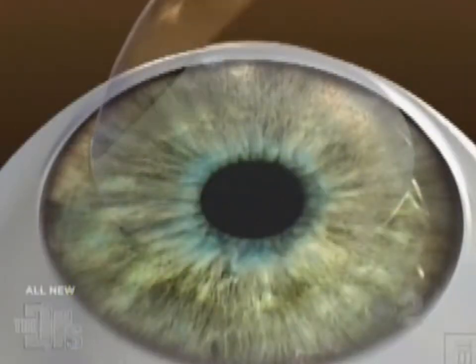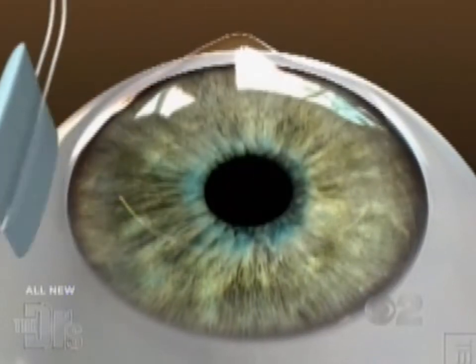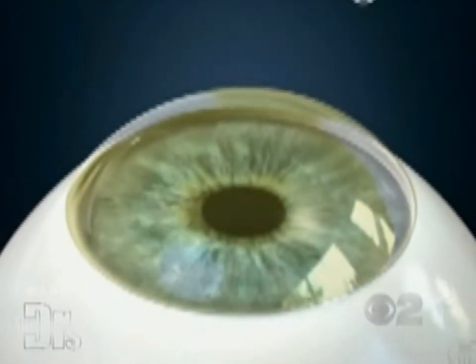What we're doing with the advanced LASIK is we make a flap and we lift it up. We use the laser to reshape the cornea and that removes a little bit of tissue. Then we put the flap back where it heals and bonds back. What we did with making it fortified LASIK is we married advanced LASIK with a procedure that I invented that strengthens the cornea. That procedure is called Holcomb C3R. At the end of the LASIK procedure we have a special cross-linking solution that we developed. We place it underneath when we put the flap back, and a special light actually strengthens the cornea — which long term helps give you more stable vision and reduces any chance that you would need a touch-up laser in the future.